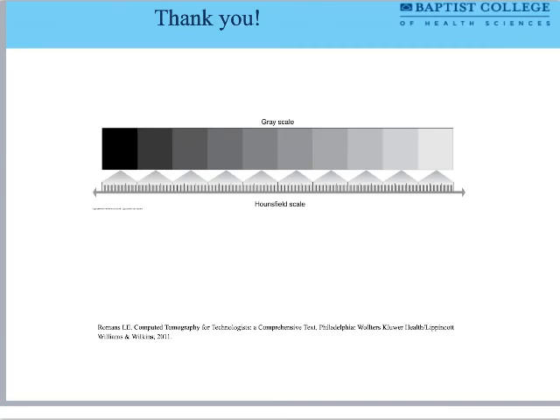And this last thing I'll say by way of thanks is just, I like this. It's actually tying the Hounsfield scale to different gray and white values. And it's helpful again to remember, as we go up on this Hounsfield scale, we'll expect the colors to get whiter. As we go down on the Hounsfield scale, we'd expect them to get darker.